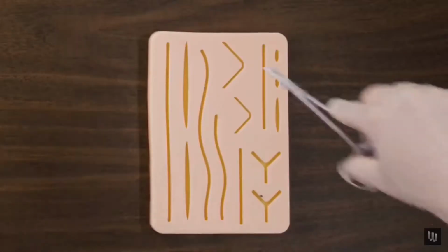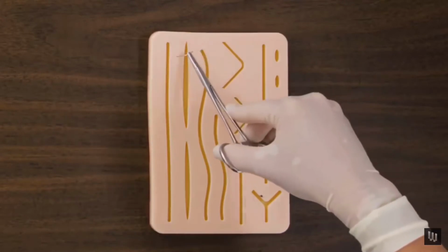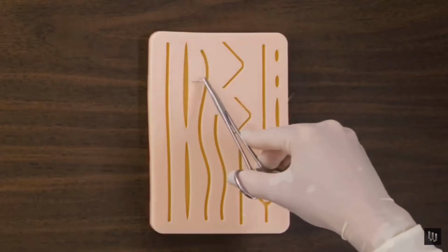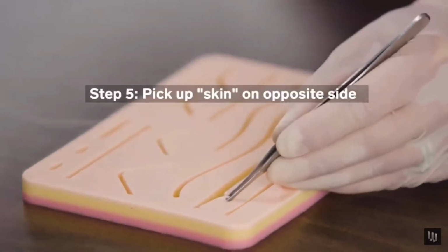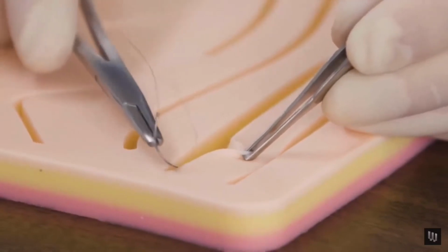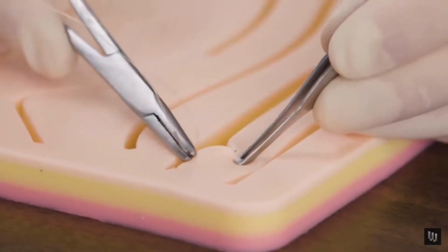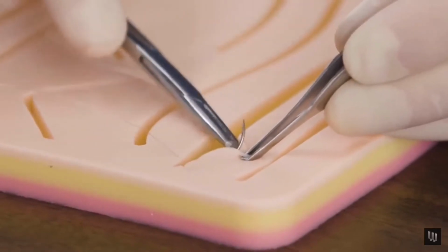So then a running subcuticular closure, if you use your imagination, is going to end up like a series of C's in the plane of the skin. So then your next bite, you're going to evert the opposite side of the skin. You're going to enter the tissue sort of exactly opposite to where you came out. And again, you're just going to kind of run along the dimension of the skin just like so. You're going to use the back of the needle to push it along.